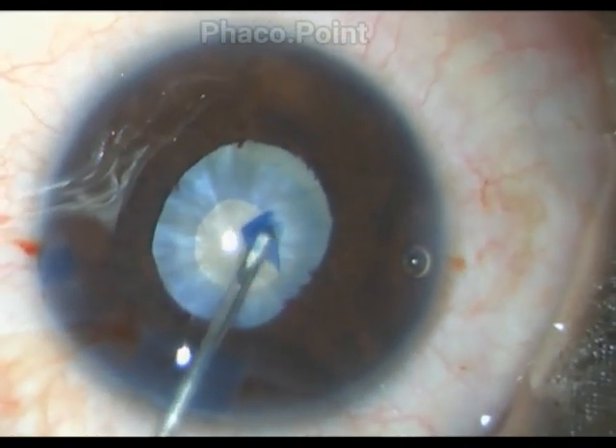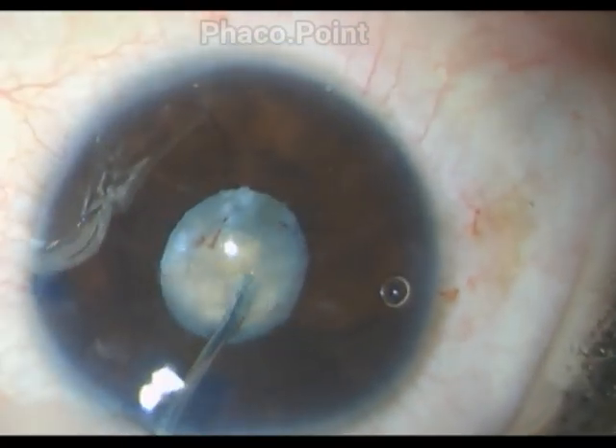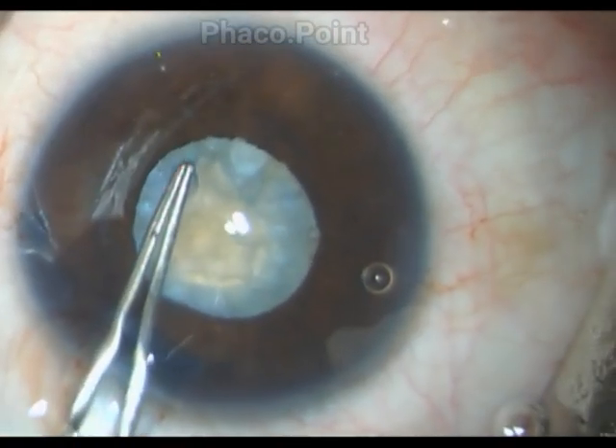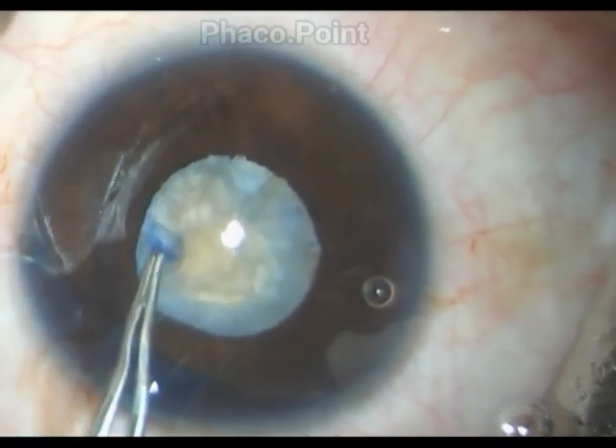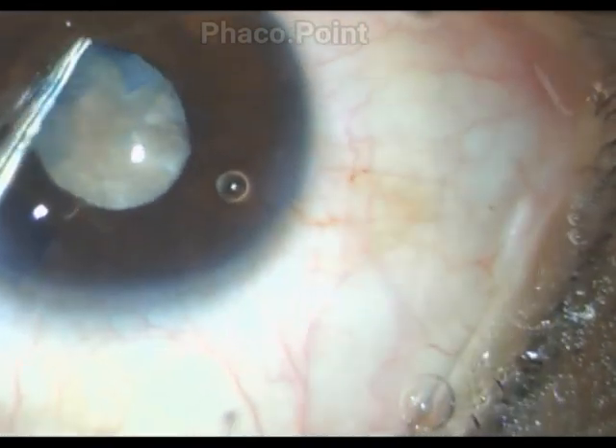When I start the rhexis, I make a tiny circular rhexis first. This results in decompressing the bag. Now, once more, when I make an outward nick and grab hold of the capsule with the rhexis forceps, I don't have any forces within the lens anymore, and thus I'm able to control the rhexis extremely well, with very little propensity of it running out into the periphery.